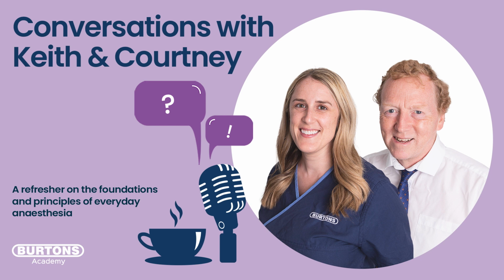But we did say that our pressure wants to be 10. So let's go up and set our target pressure on our pressure cycle ventilator to 10 centimeters. On the SAV we can't set the inspiratory time per se, but what we can do is calculate our fresh gas flow rate based on the T-piece configuration, and adjust it so that the reported time for IT on the screen says 1 second. So we'll set our pressure for 10.